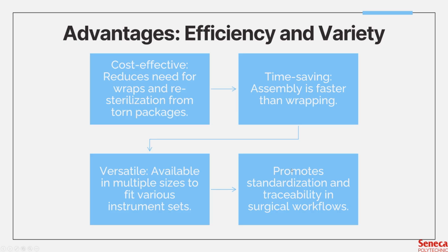Most manufacturers offer modular designs, allowing multiple baskets or inserts to be stacked on top of each other for each surgical team's needs. So this flexibility actually helps technicians organize instruments consistently and speeds up setup in the operating room.